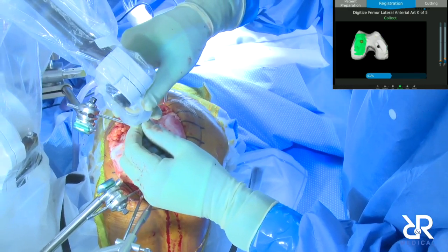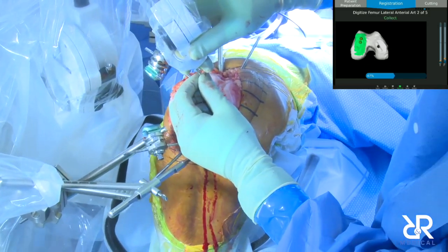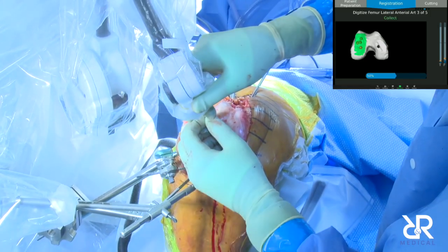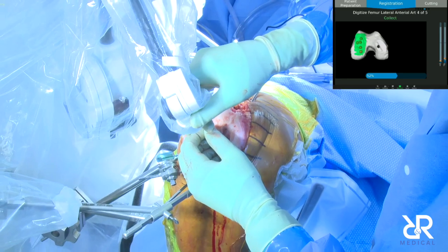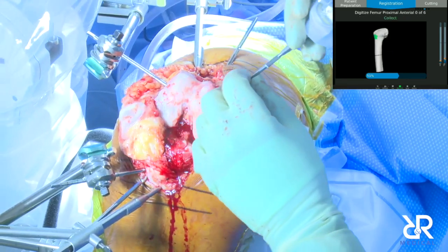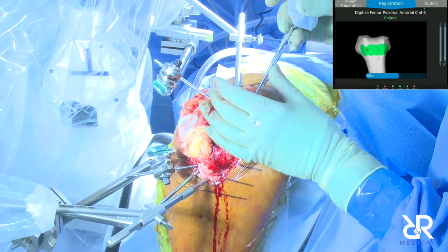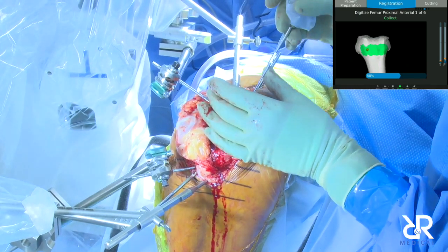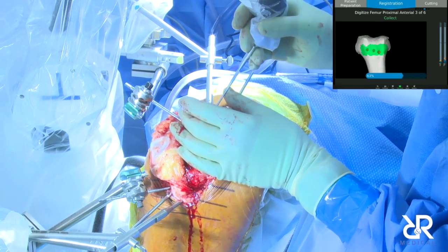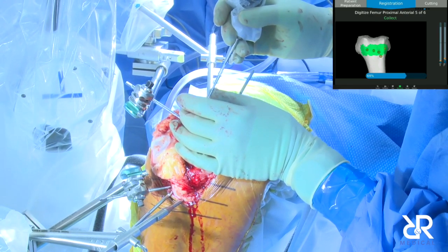Yeah, it's all about accuracy, right? And there's really two components here. There's accuracy, and then there is preoperative planning. One of the nice things about robotic surgery is before you ever get to the operating room, you know exactly what you're going to do. You know what size and what implant you're going to use, so it just really prepares you.